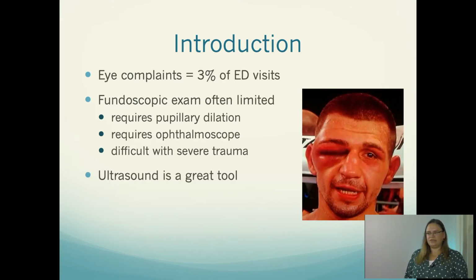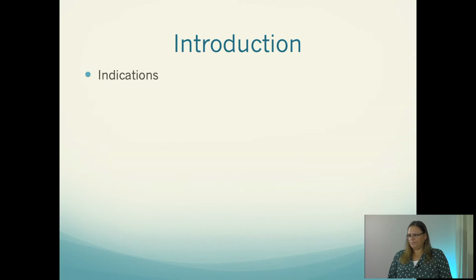So eye complaints comprise about 3% of ED visits, and I don't know about you, but the fundoscopic exam for me is sort of the white elephant. It can be very difficult depending on patient cooperation, plus or minus whether you can find an ophthalmoscope in a time-sensitive period. It can also be very difficult with severe trauma if there's a lot of periorbital swelling or bruising to do a good visual exam. So ultrasound is a great adjunct tool to your visual exam.